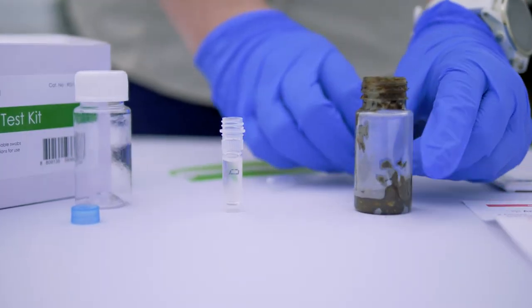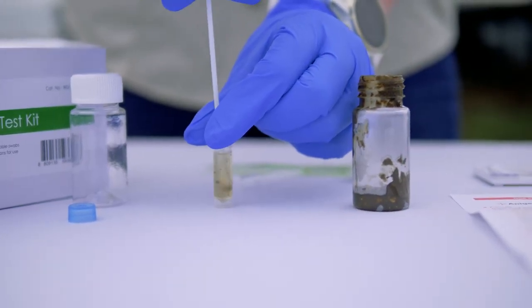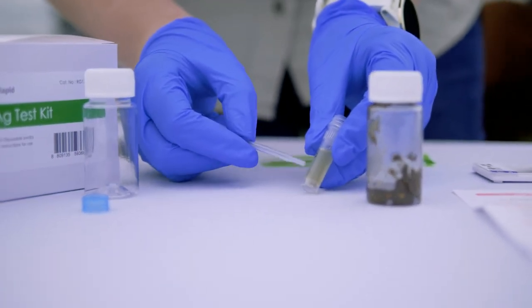You collect your sample and mix it in the diluent. It's really important that you mix it well, then give it time to let the sediment settle to the bottom so that the part of the diluent you collect is free of solid material.